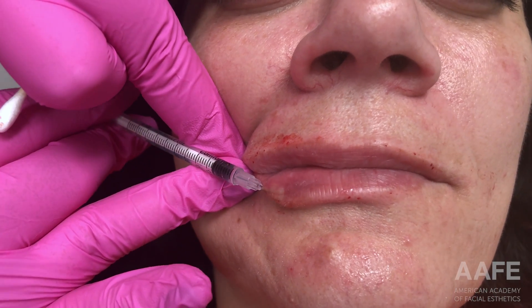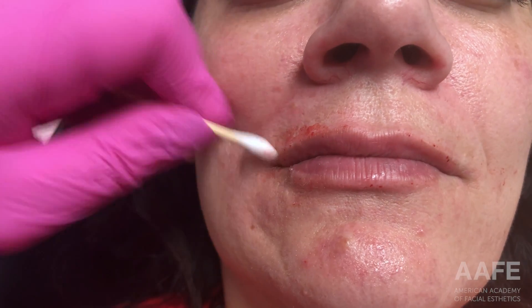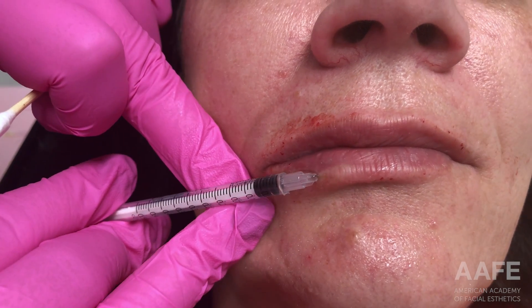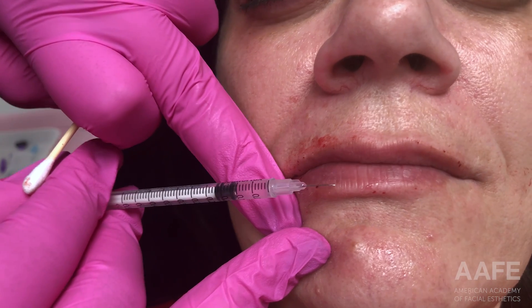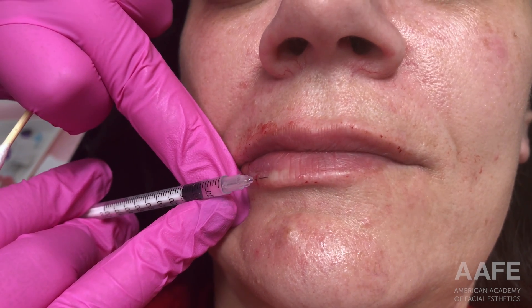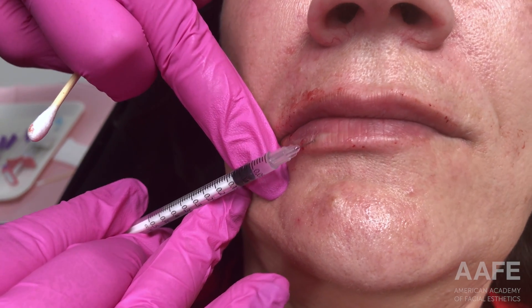It works just as well, but as I said, you're obviously pushing less product because it's a smaller-gauge needle, so I tend to push a little harder and push a little more product for those linear threads of standard volume, just to ensure I don't have to poke the patient as many times. You can see my depth and the blanching of the lip — which is what you want when injecting lips. You never want to be so deep that you don't see any color change to the tissue, and you never want to dive deep in anyone's lip, to avoid any kind of vascular event.